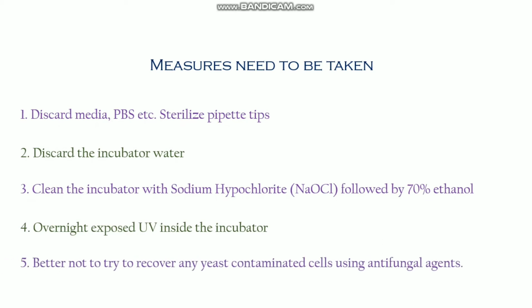And it is better not to try to recover any yeast contaminated cells using antifungal agents. If you have plenty of cells available that you culture, don't try to recover those contaminated cells.